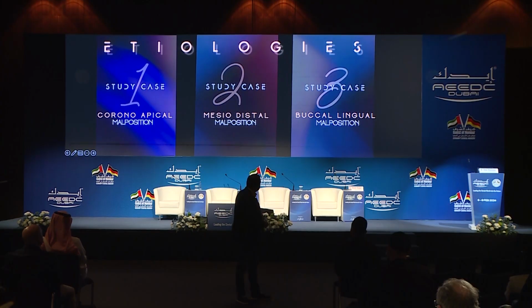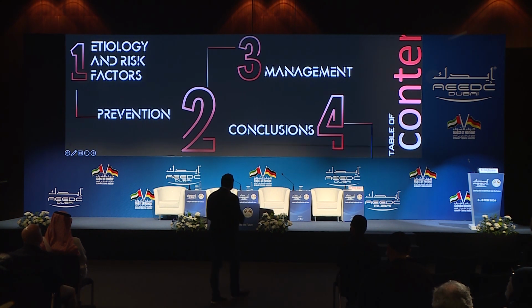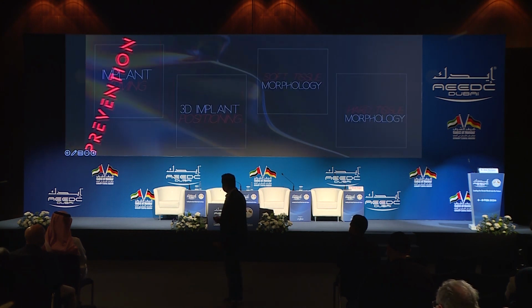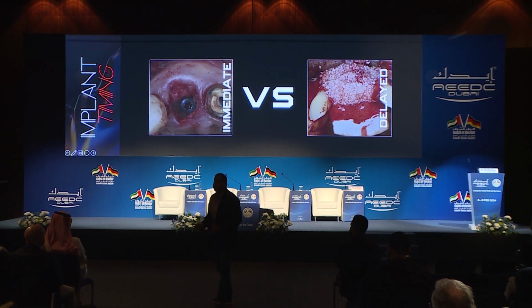Why do we have these complications? Why do we place our implant badly? Obviously you have three positions when it comes to placing your implant. In these 3 positions, we will try to see how we can prevent this from happening. So the best treatment, my friends, for complications is not to have them in the first place. And how do you prevent this from happening? Well, if it's an advanced case with advanced bone loss or soft tissue loss, just stage it. Don't try to do everything immediately.